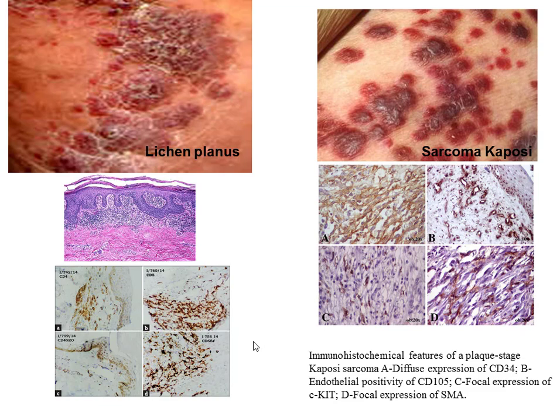On the left side, it's lichen planus. On the right side, it's Kaposi sarcoma, a malignant tumor.